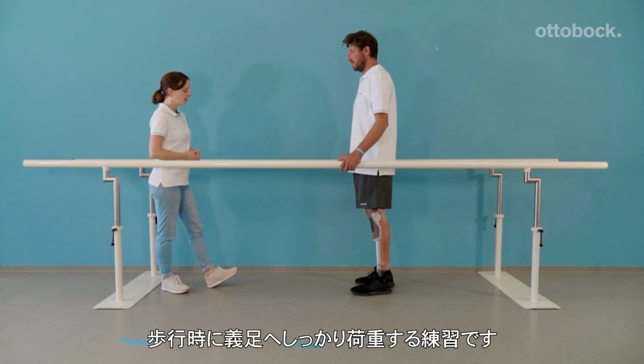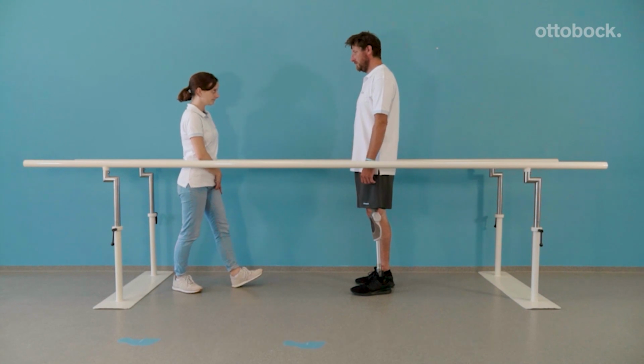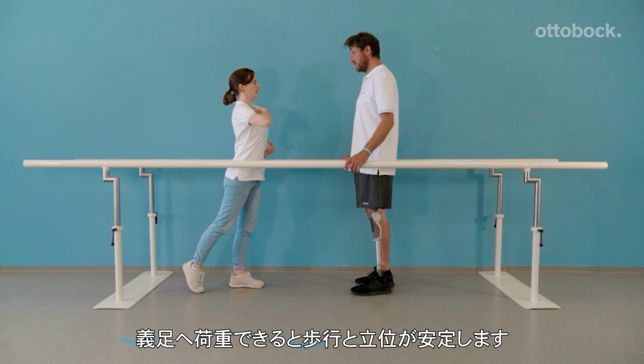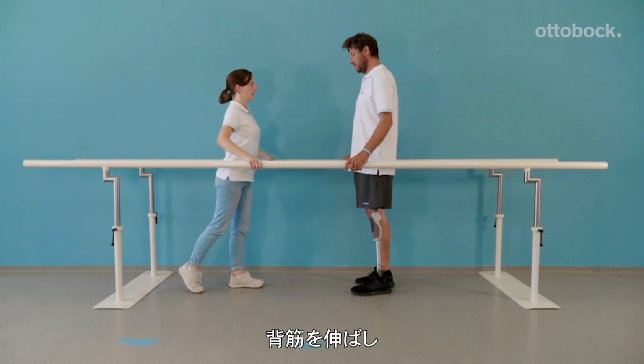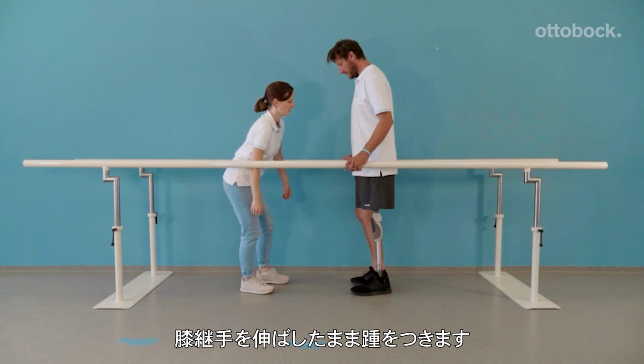In this exercise, the goal is to learn how to bring the body weight on the prostheses with an upright posture, which is one of the requirements for confident walking and secure standing. Avoid hyperlordosis of the back and keep the prosthetic knee extended.